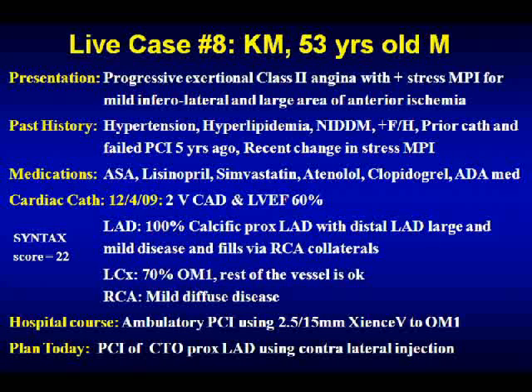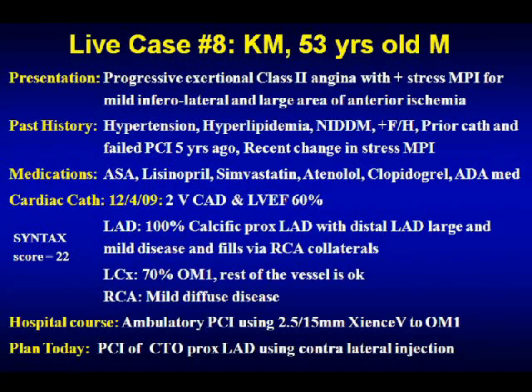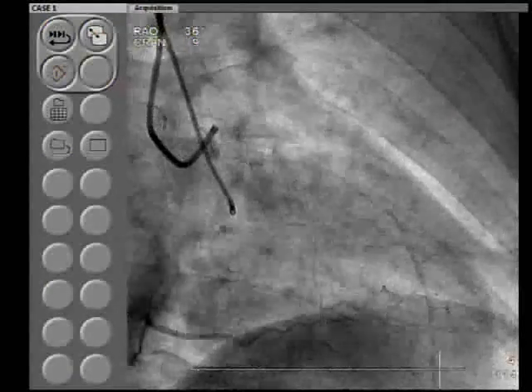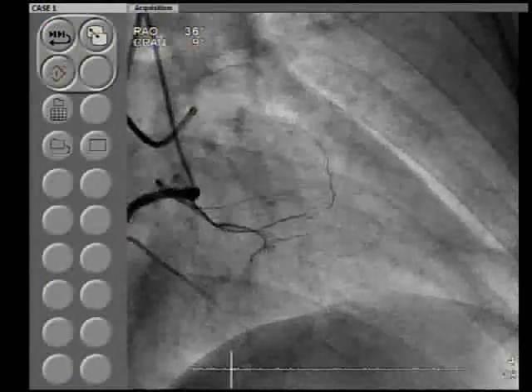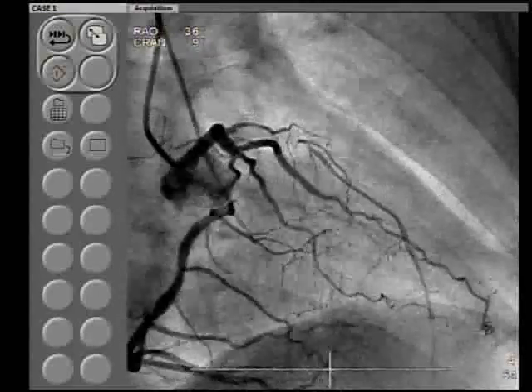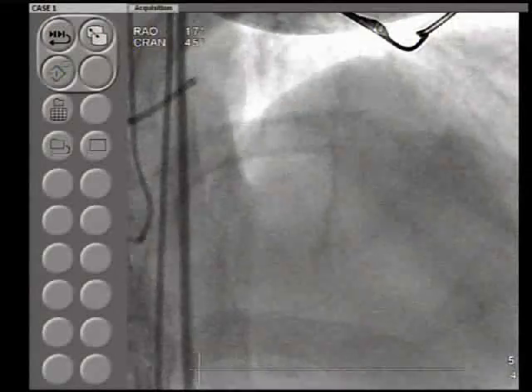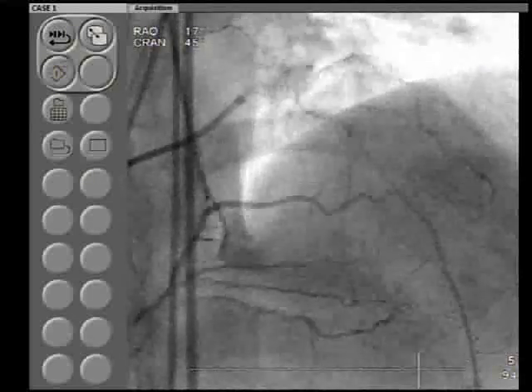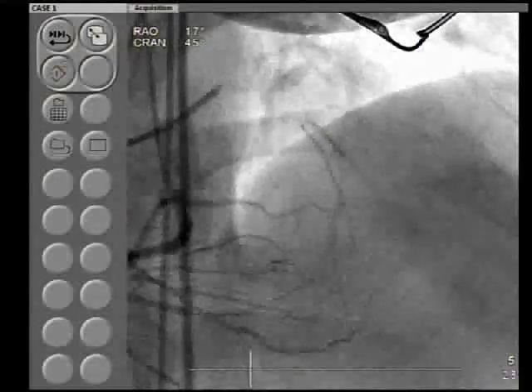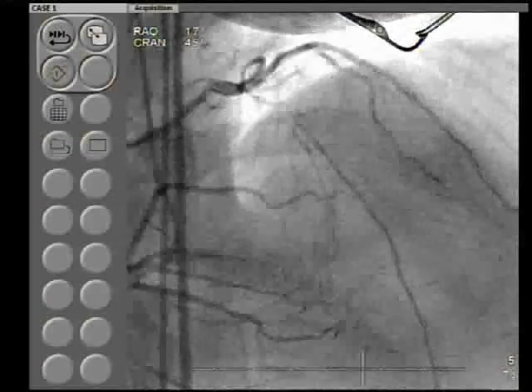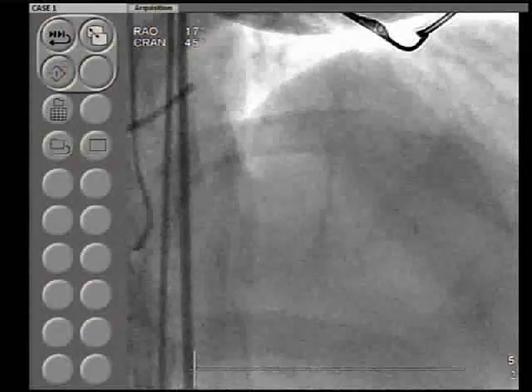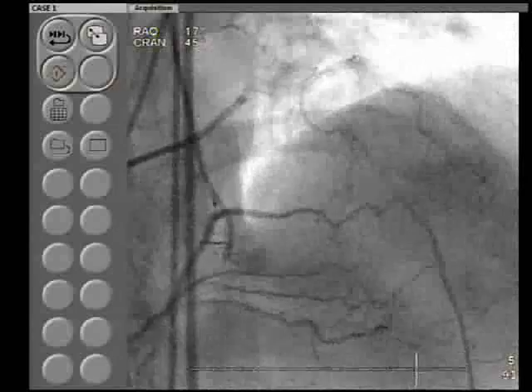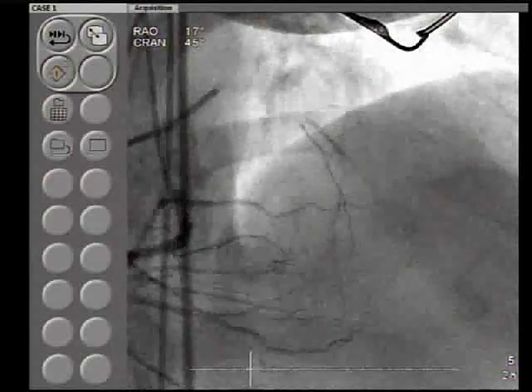On the left system the left main is non-obstructive, the circ stent looks very good, and the LAD total occlusion is right after a couple of millimeters from the origin of the LAD. In the cranial view, before the major septal, it becomes proximal LAD. There is a small diagonal at the very beginning, and probably a 1.5 to 2 millimeter diagonal at the distal end of the total occlusion. The question comes: what would be the approach?